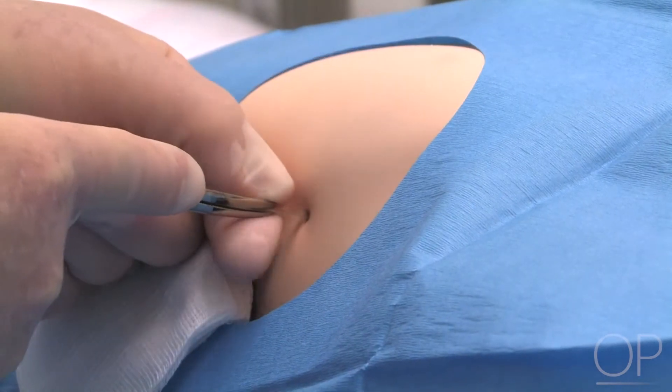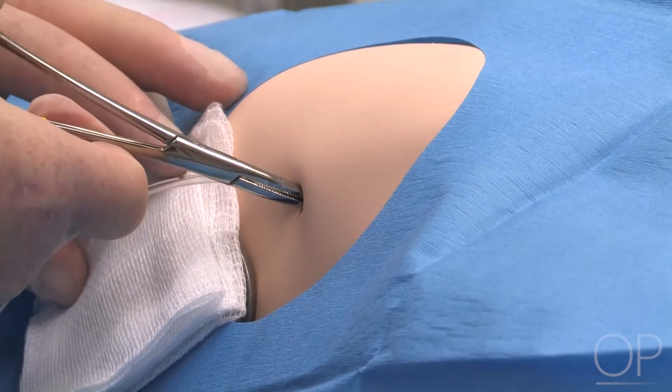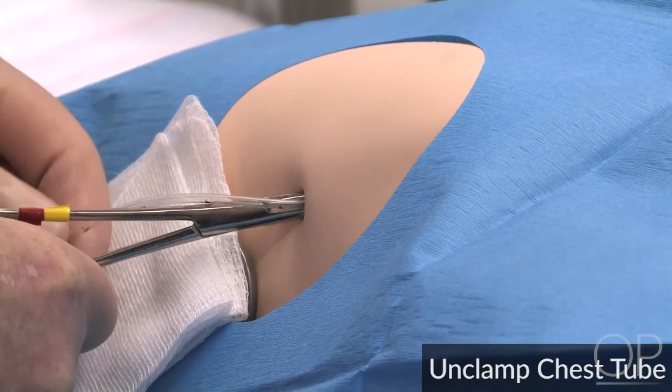Enter the previously made track and enter the pleural space. Once inside the space, turn the Kelly Clamp 180 degrees. Unclamp the chest tube.